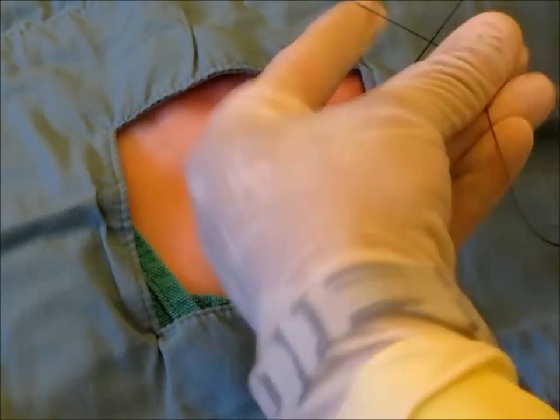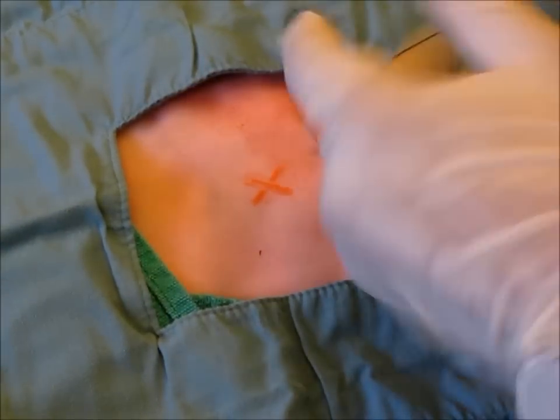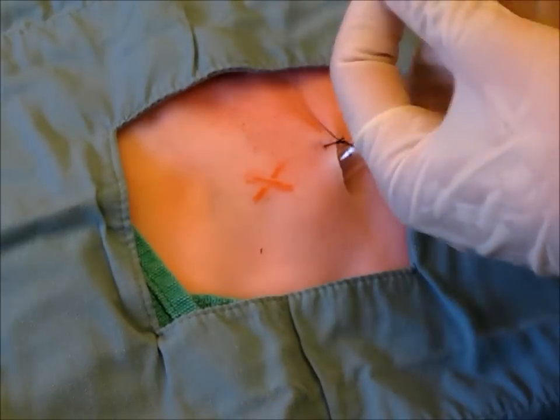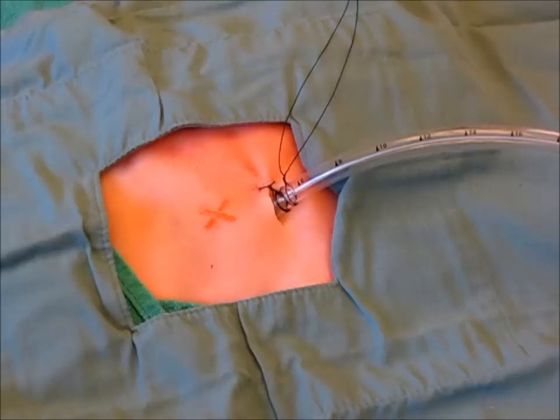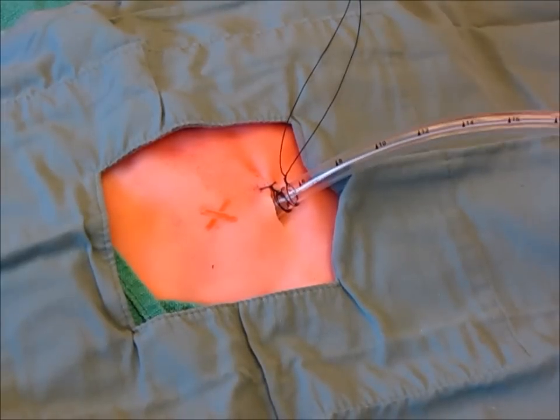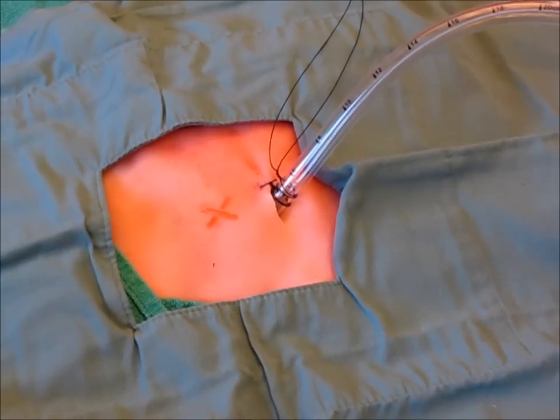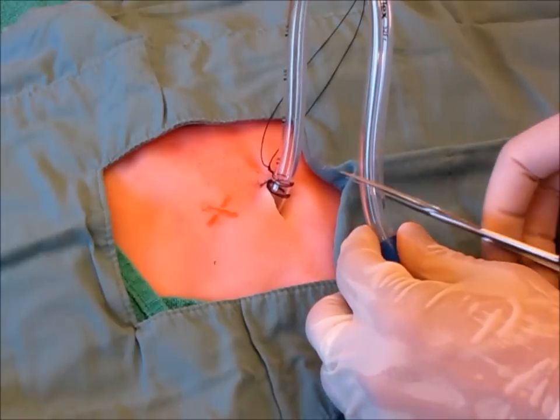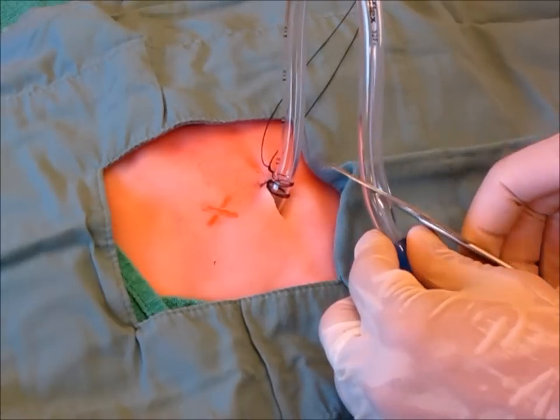You can keep the chest tube on the chest. The chest tube is now ready to be connected to our drainage system. To prepare the chest tube, cut it at the distal end at an oblique angle.